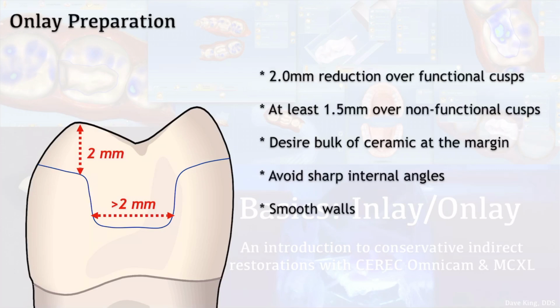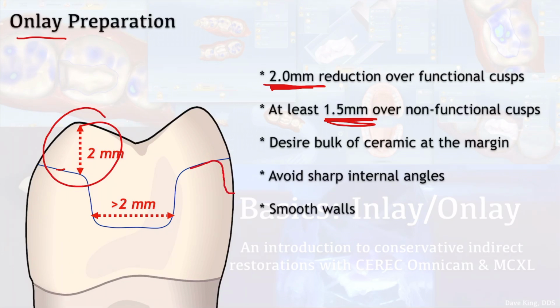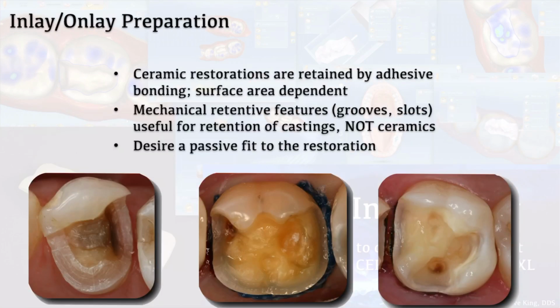Okay, the only big difference between inlays and onlays is the amount of reduction over the cusp tips. This essentially applies to almost all ceramic crown restorations: 2 millimeters over functional, 1.5 over non-functional. We don't need to worry about metallic principles of retention form, because these are going to be bonded in place. So, nice straight exit angles that'll give you a wide band of enamel to bond to, really high bond strengths. So bonded, again, we're not cementing.